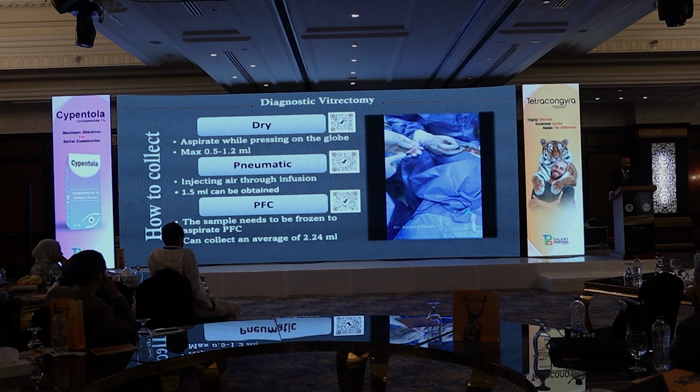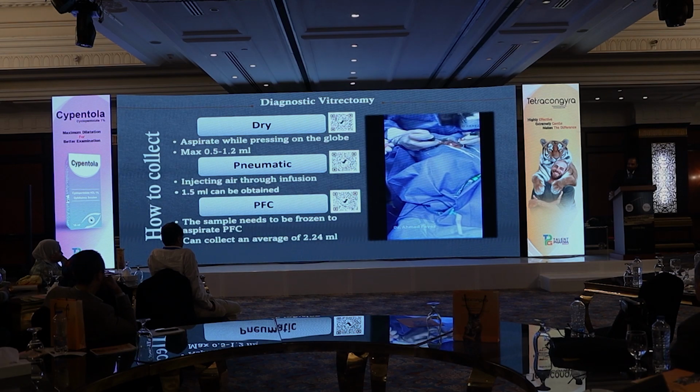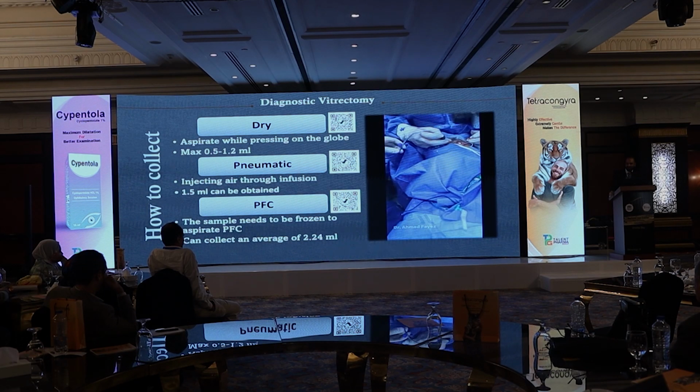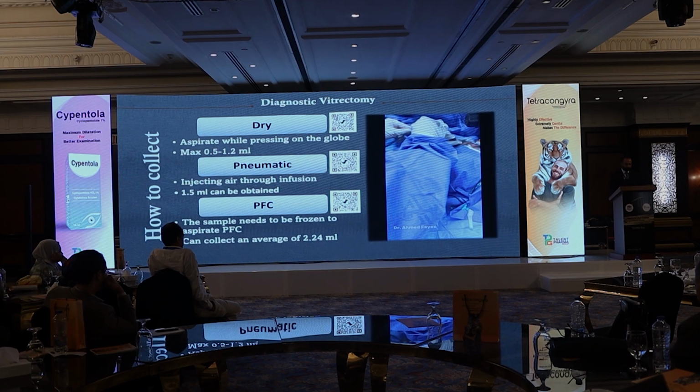But don't do what we did the first time. Dr. Nawara asked us for a tap. I opened the infusion wide open and was very happy that I was collecting a sample, and in the end of course it gave no results because it was diluted. This is for diagnostic vitrectomy.